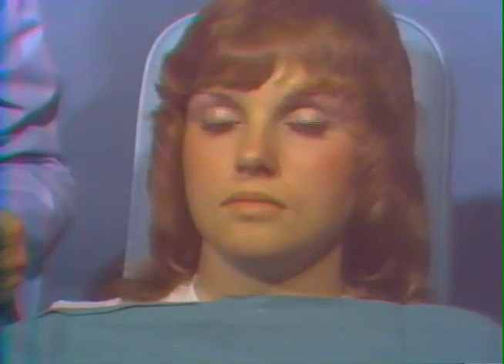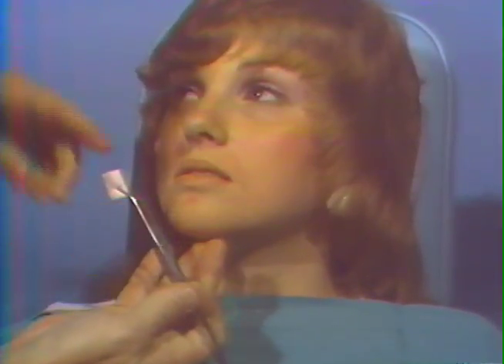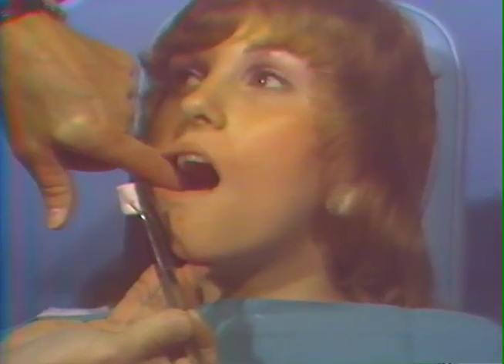I will now demonstrate two methods for placement of the cotton roll in the lower arch for injections of the inferior alveolar nerve or the lingual nerve. I will now demonstrate one method of utilizing the cotton roll for topical analgesia of the lower right inferior alveolar nerve and lingual nerve. Turn your head a little bit towards me, open wide just for a second. Let me retract your cheek.